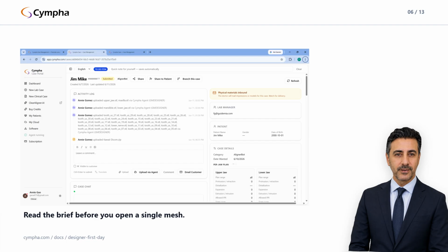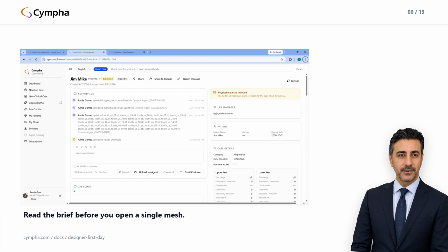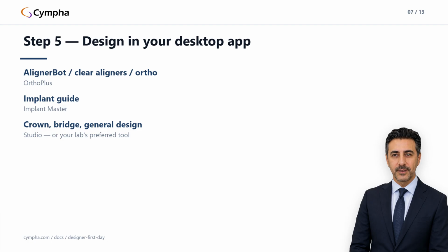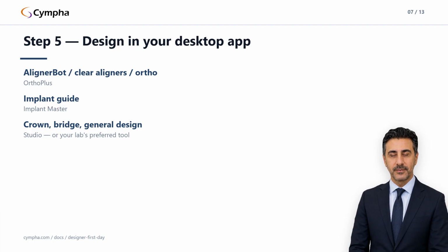While you work, the agent manager keeps watching the workspace folder for new files that are queued against the case. Which raises the obvious question: what happens when you save your finished output into that folder? That's the next slide, and it contains the one rule worth memorizing on day one. Save your finished deliverable, an STL, a transfer pack, a review file, whatever the case's deliverable is, into the patient's workspace folder. What happens next depends on the file type, and this split is the rule to memorize.